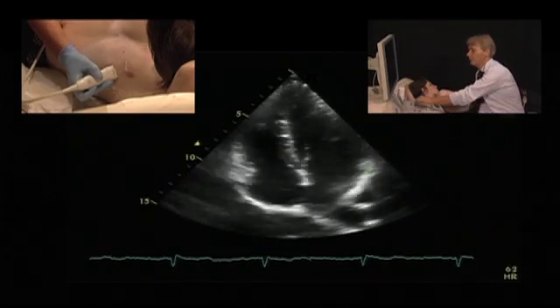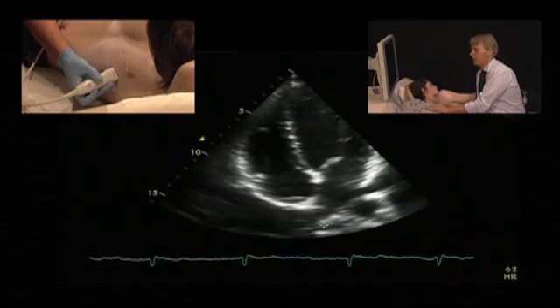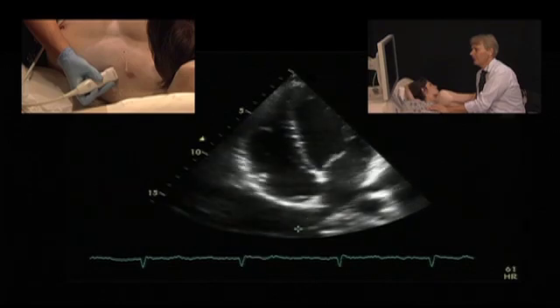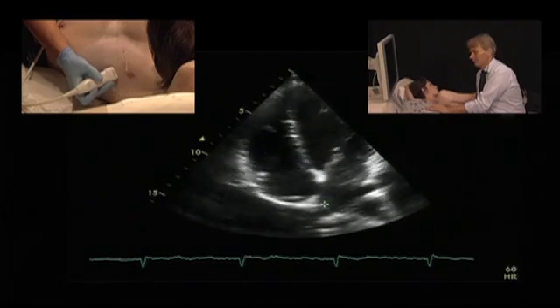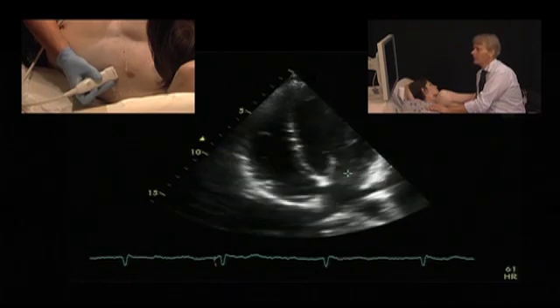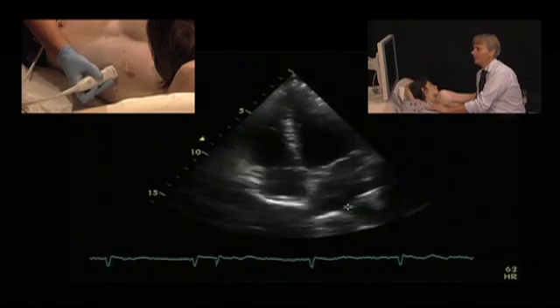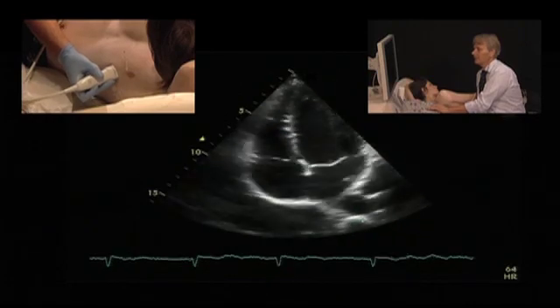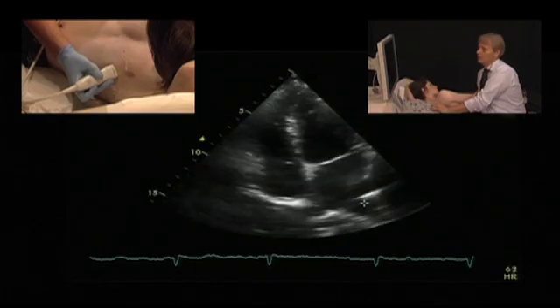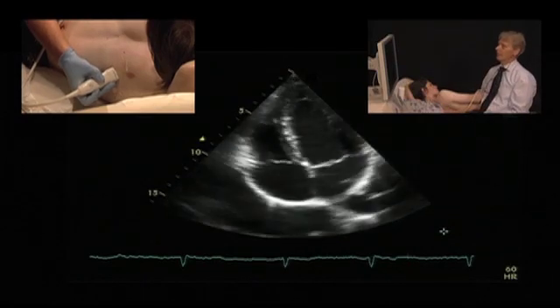If you want to go into more details, we can even see the pulmonary veins as they enter the left atrium. This is the right upper pulmonary vein. Those are the left pulmonary veins — the lower and the upper. And here you would see the descending aorta, orthogonally visualized.